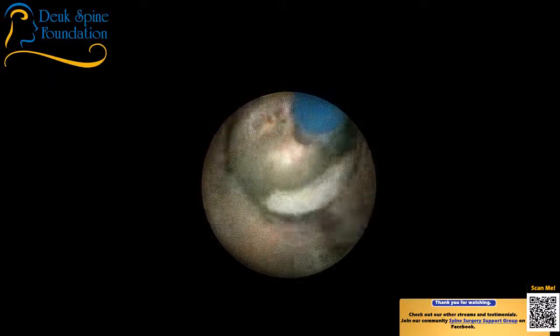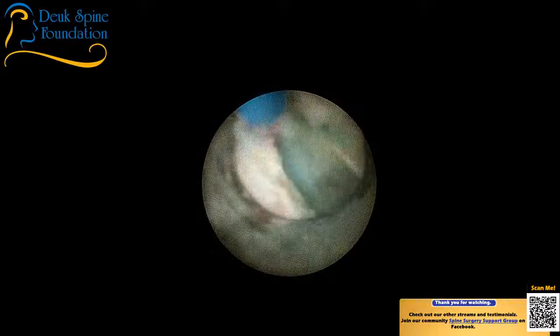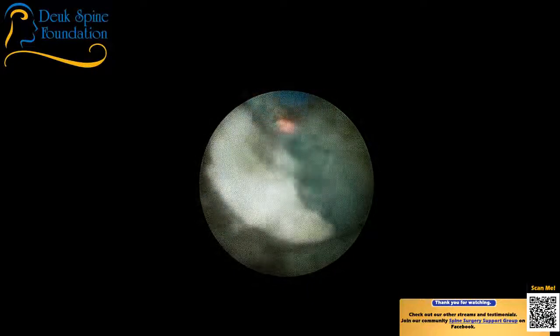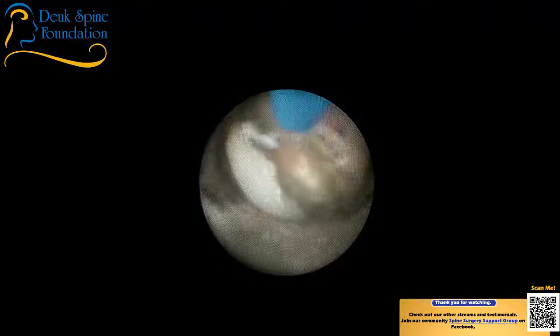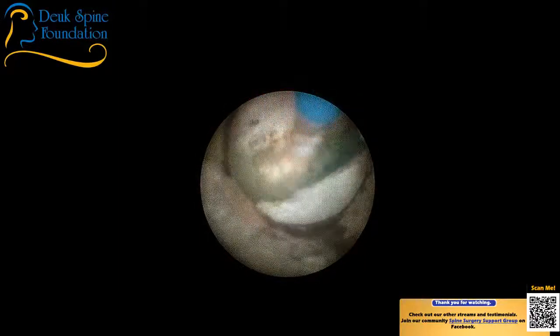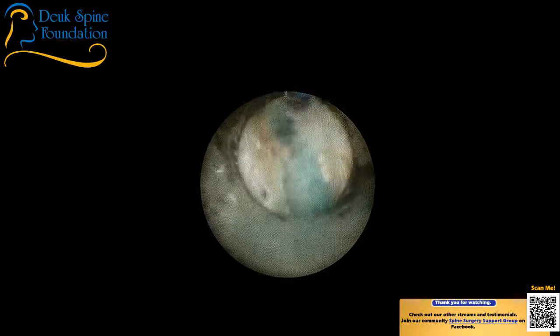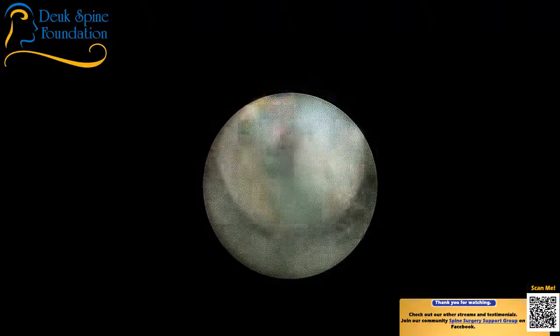By the way, that's the posterior ligament there. I've gone across from one side to the other. All the herniation is out. I'm very happy. We actually found herniation on her right side, though her symptoms were really mostly on the left. We got the right herniation out as well. That'll help her.